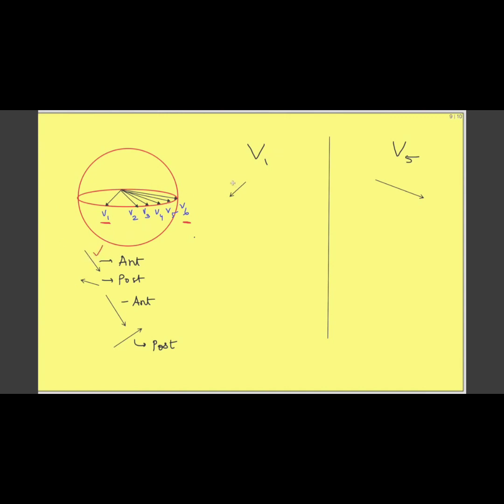First let us see atrial depolarization. You just see how it is with respect to the direction of lead V1. It is around 90 degrees but still acute. So a positive P wave will be recorded but very small, since it is near 90 degrees. In V5, it is along the direction of V5, so a positive P wave will be recorded but of larger magnitude than in V1. Then septal depolarization is again almost 90 degrees, so maybe no recording. For V5, septal depolarization is in the opposite direction to V5, so it will be recorded as a negative wave.